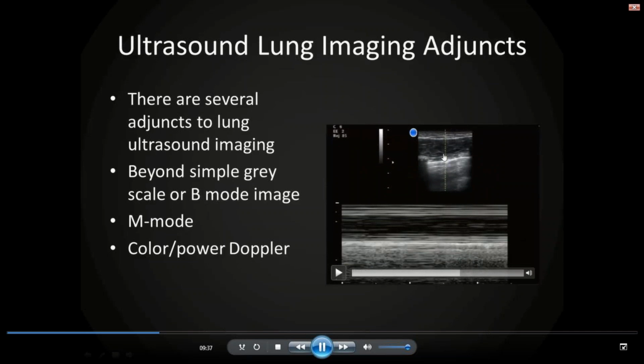All of this soft tissue is going to be still, obviously, except for some minor breathing movement, and we have a smooth, continuous display. And then the pleural line, which corresponds to this bright line here. And below it, there's movement back and forth, back and forth. Now, this is just a continuous artifact of the pleural line. We're not really seeing any deeper.